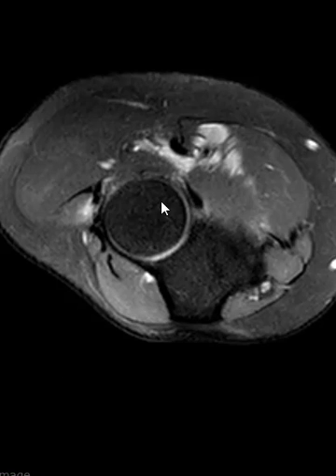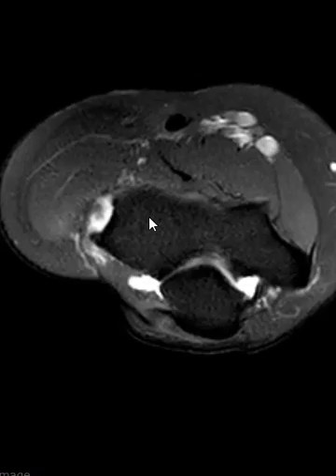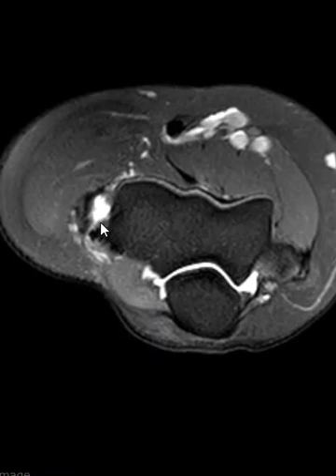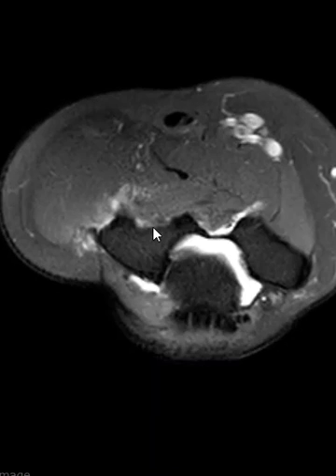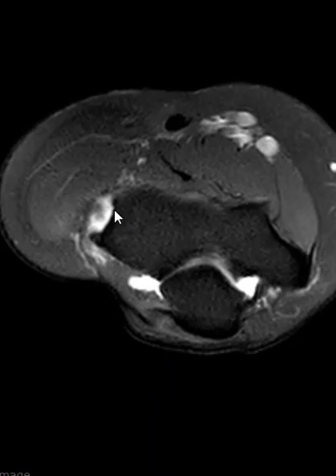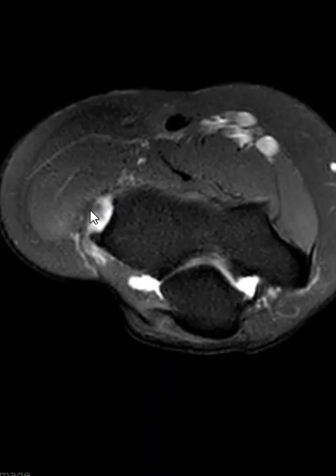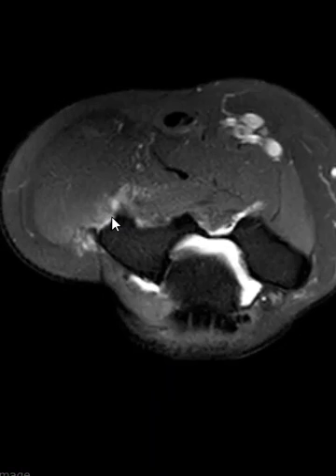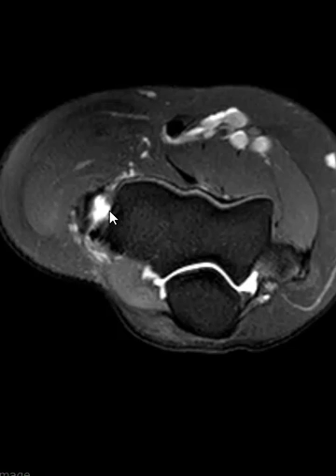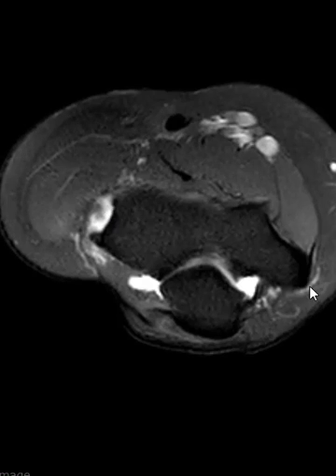Now here's an axial view with the radial head here. We're going to come back up, and right here we see that fluid signal. Right here is the bony attachment — see how that's scooped out, we don't see the tendon at all. It's just fluid filling that space, so it looks like it's torn from the attachment and retracted down a little bit.